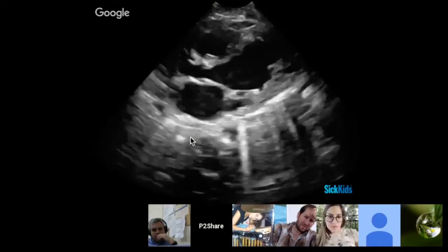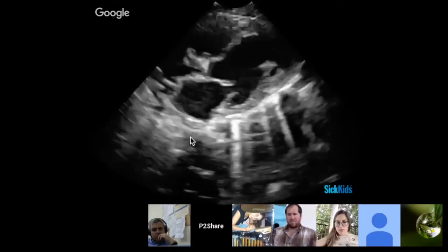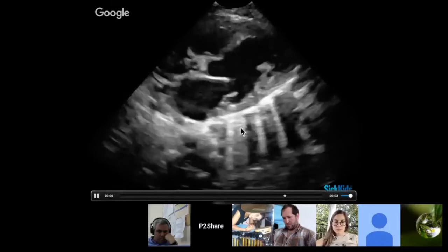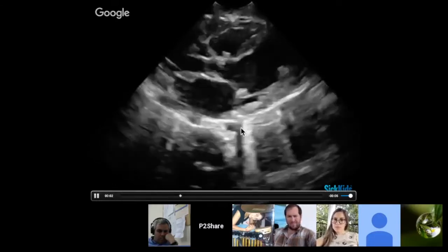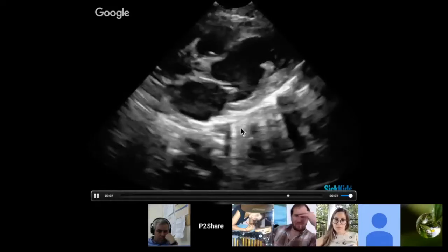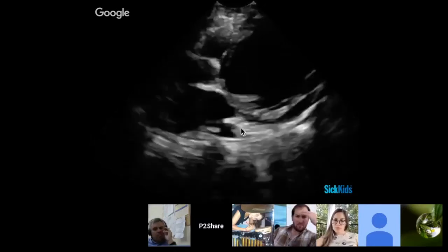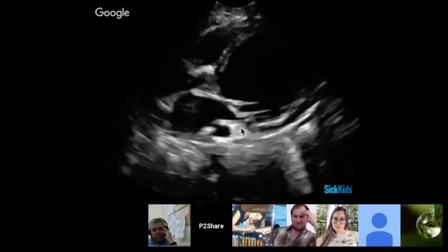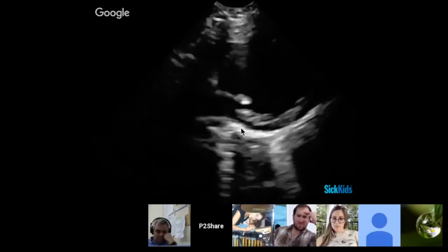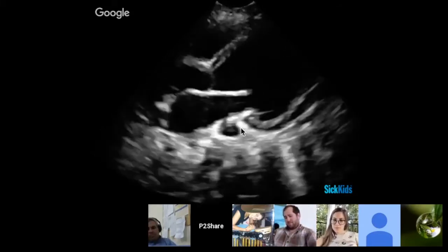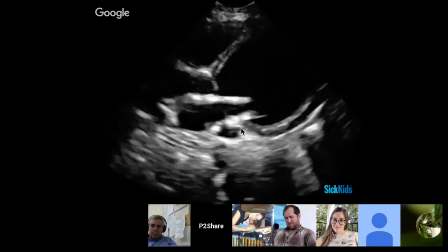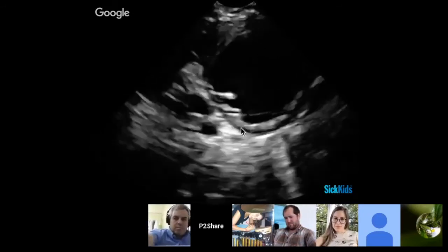This case shows very poor function — the heart is not giving a high five, so to speak. The parasternal long axis is your best view for looking at functional abnormalities of the heart. There are B-lines at the back, perhaps suggesting a kid in failure — that fluid could be from a SIRS kind of picture versus CHF. Another example shows poor function with a dilated LV, likely a dilated cardiomyopathy or equivalent. Whether this patient is at their baseline — as some kids may be — or coming in acutely unwell, the parasternal long gives you that information.